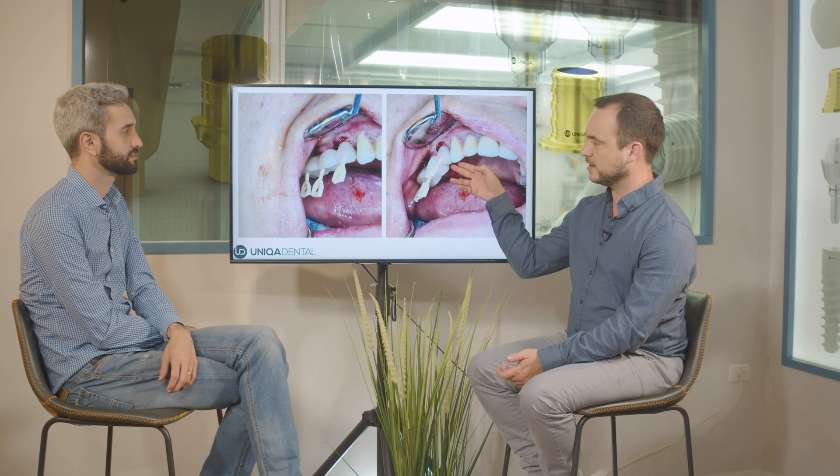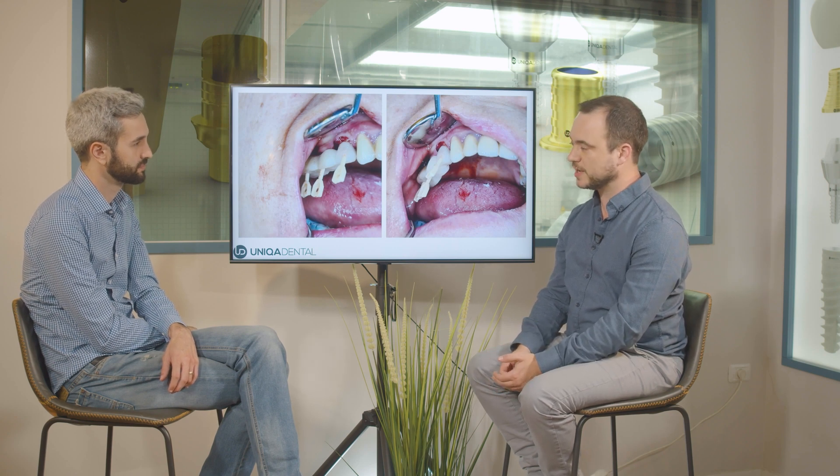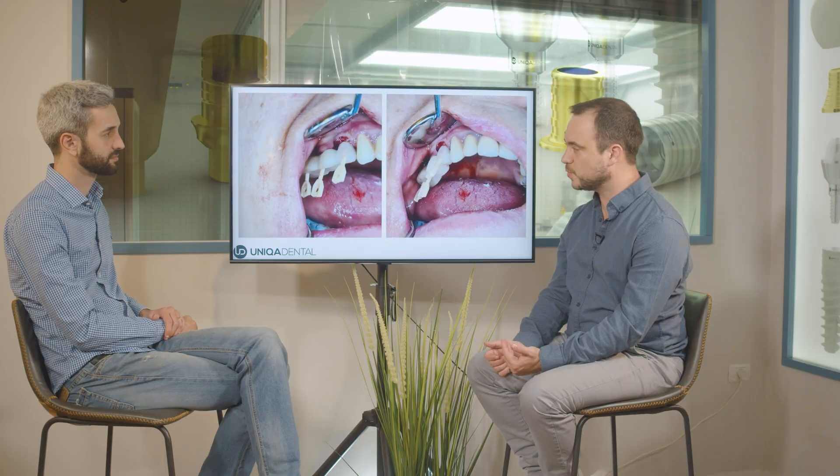This is the temporary bridge. In this case you don't have any teeth opposing those two molars — you only have occlusion with tooth number 14. So for tooth 14 you'll want to make it a little bit shorter so you won't have any excessive forces, because it's a freshly placed implant. But overall you're quite safe because you already have two osseointegrated implants, so this bridge will hold and be quite strong on those three implants.